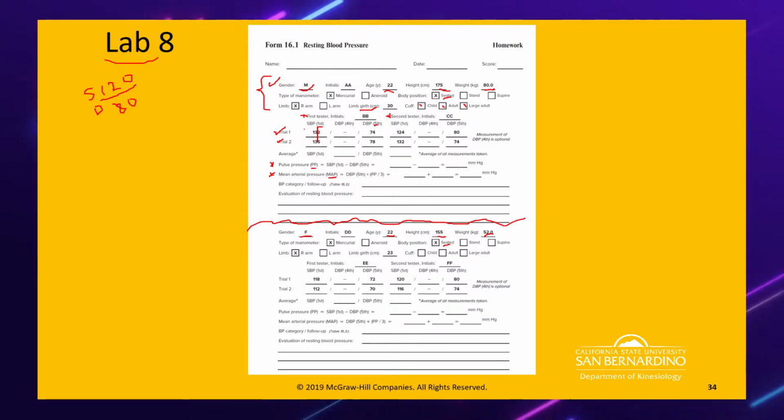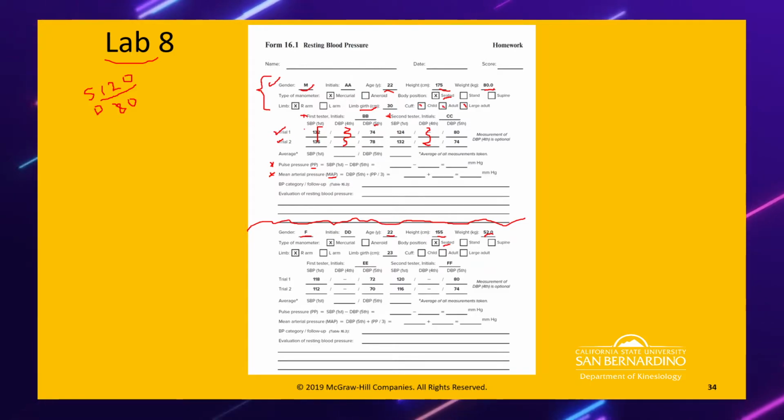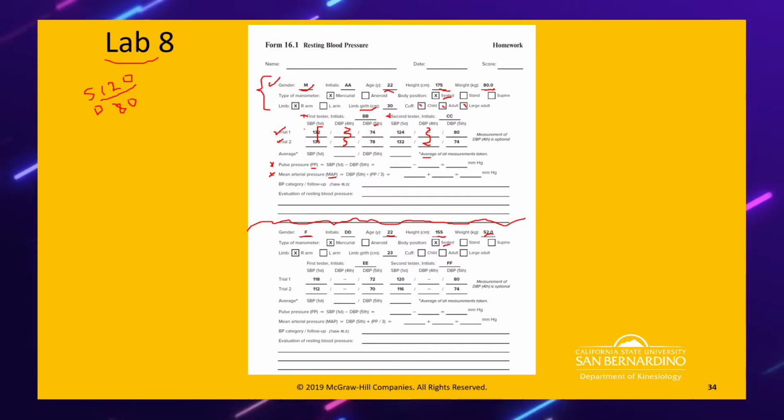So does it really matter that there's a fourth sound not reported? Not for our intents and purposes. So don't feel like you have to report anything there. We really just need these two measurements. So moving down to the average, because we have two different measurements, we want to average them up. As you can see right there, average them up.